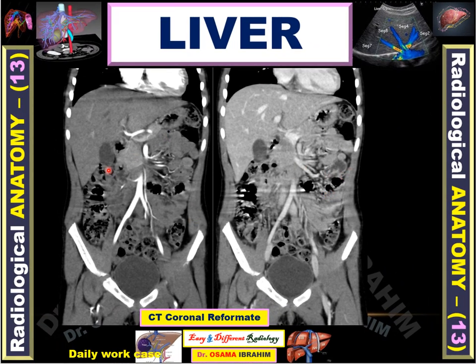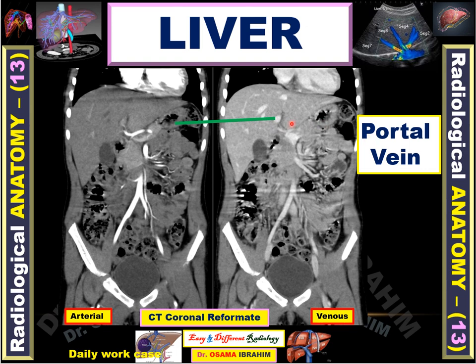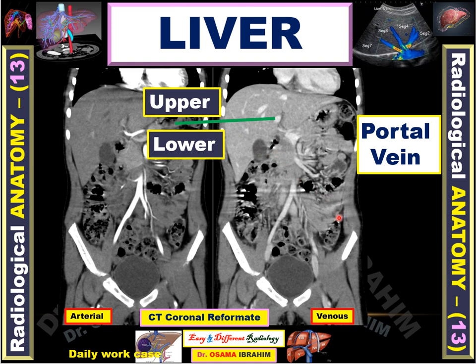This is coronal imaging in different phases. In the venous phase, the aorta, portal vein, venous structures, and multiple vascular structures in the liver parenchyma are visible. In the arterial phase, only the arterial branches of the hepatic artery are shown. At the level of the portal vein shown in this coronal image, I can divide the liver segments into upper segments and lower segments. So the portal vein is one of the landmarks dividing the liver segments into upper and lower.